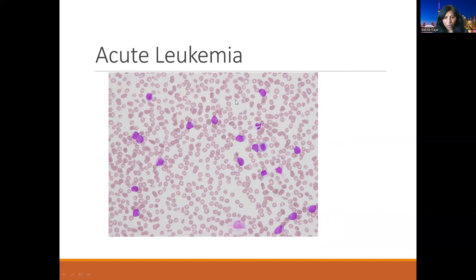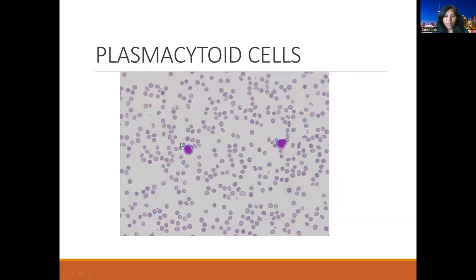These are APL blasts with Auer rods — clumped, folded, and reniform nuclei. In this image, there is lymphocytosis and I'm hardly seeing any platelets — so there is thrombocytopenia and leukocytosis. These cells have a high N:C ratio and I'm not seeing any Auer rods, so this is quite diagnostic of acute leukemia. Again, we need to compare with flow cytometry for the phenotype of these blasts.